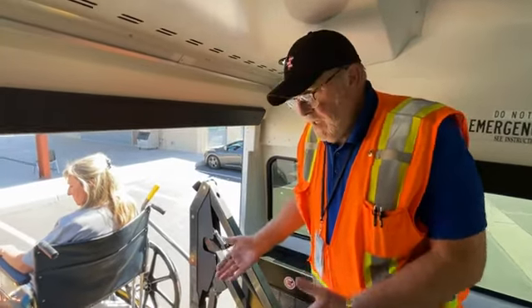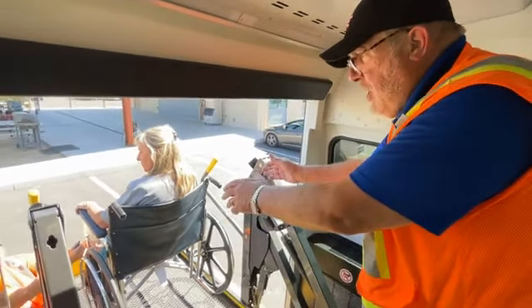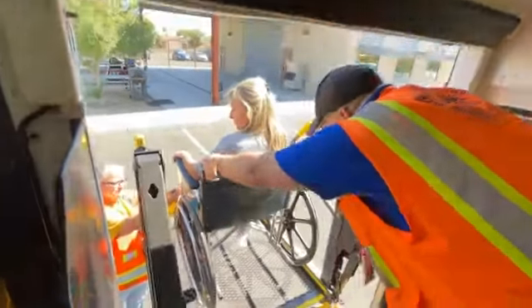Now I'm going to bring the student into the bus. I need to talk to my parent Doris — when I hold on to the wheelchair I can't go out onto the lift, so I need you to release the brakes when I tell you to. Go ahead and release them.